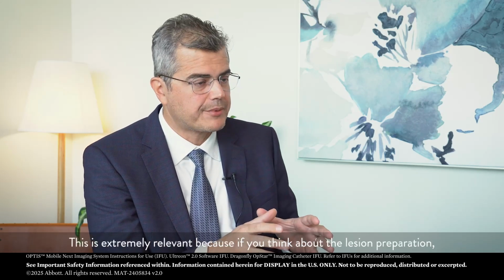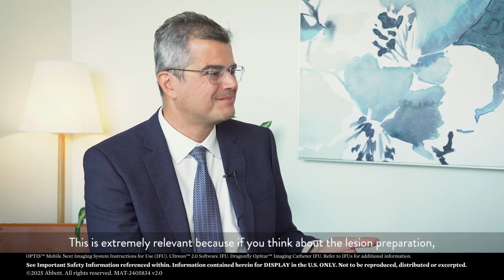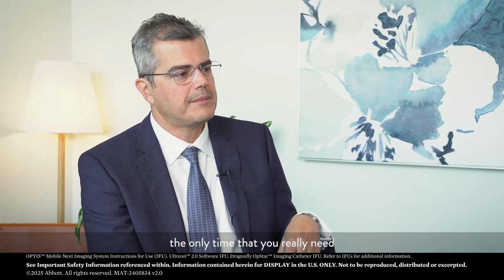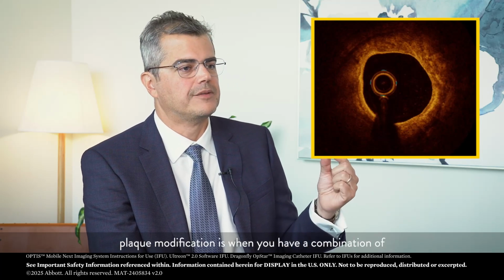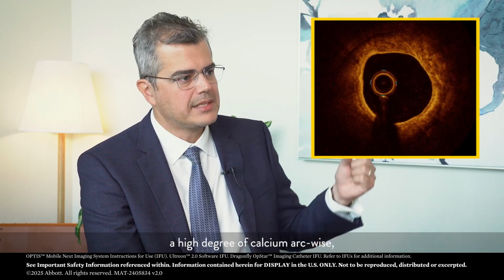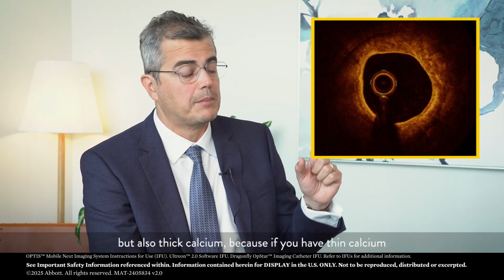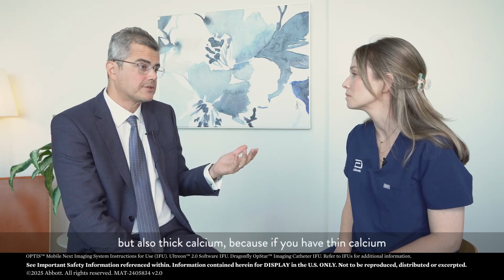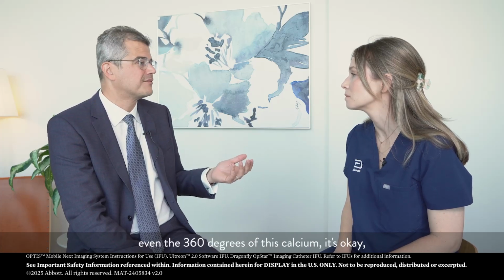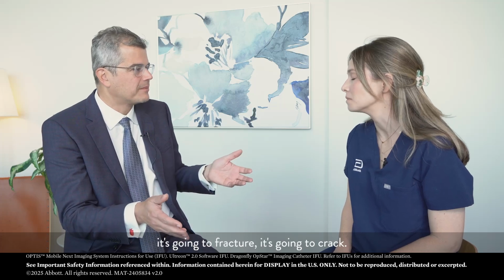This is extremely relevant because if you think about lesion preparation, the only time that you really need plaque modification is when you have a combination of a high degree of calcium, arch-wise, but also thick calcium. Because if you have a thin calcium, even at 360 degrees of this calcium, it's okay. It's going to fracture, it's going to crack, right?